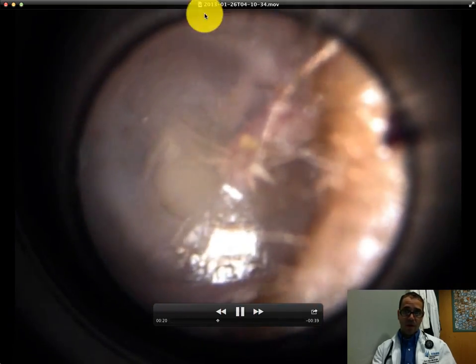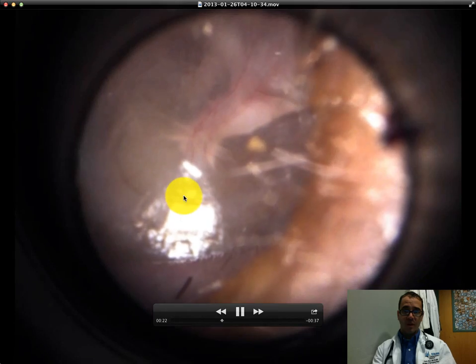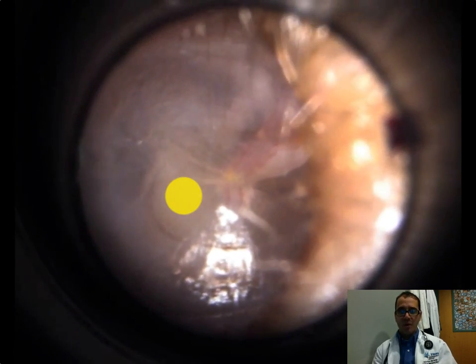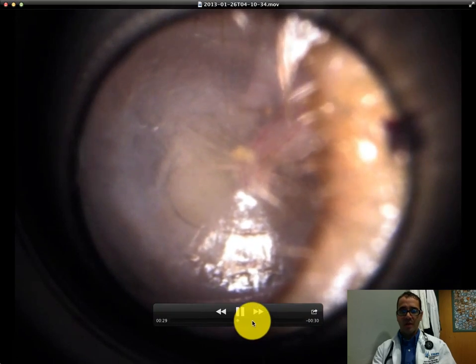There's a lot of hair around it — that's healthy. It keeps dirt and debris from getting into the ear. No foreign bodies. I'm going to go ahead and take that out and show you the other side.